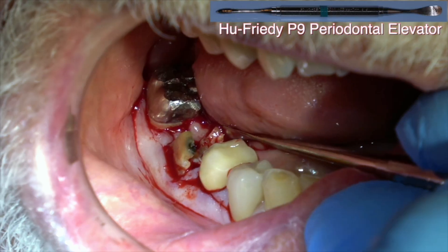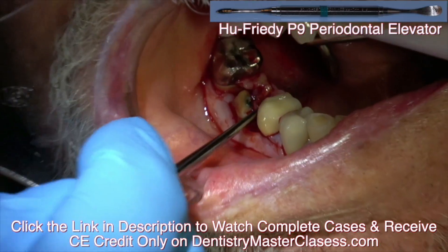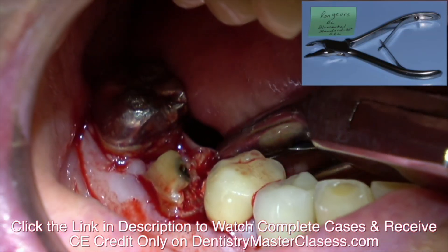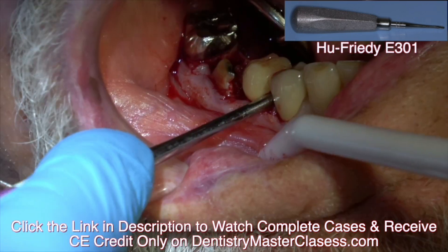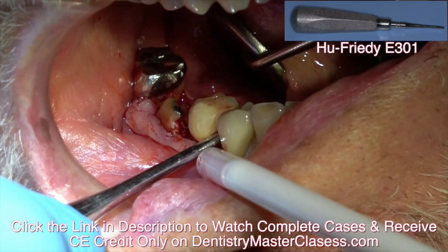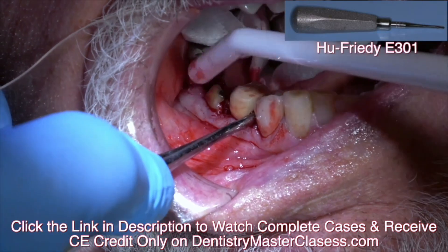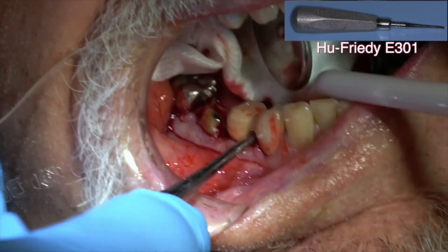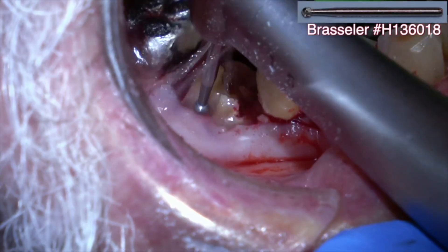I left this video in because when I'm elevating the bicuspid that has a crown, the crown comes off of the first bicuspid. I'm not trying to make this sugar-coated — this is really what happens in a real dental practice. I'm first incising into the sulcus of those teeth and reflecting a flap, then elevating the teeth. If you turn the elevator over the top like that, it puts less pressure on the tooth in front. I'm trying to create space to elevate the parts of the teeth in two.